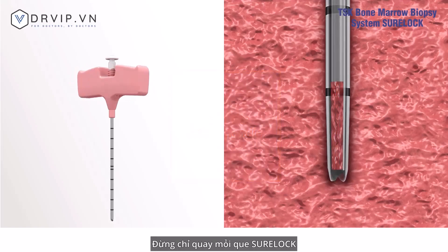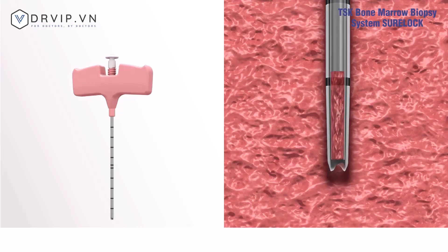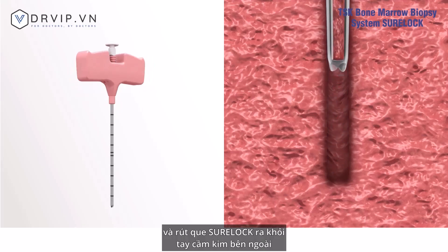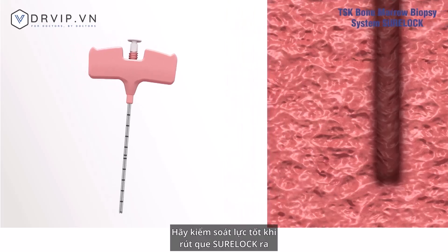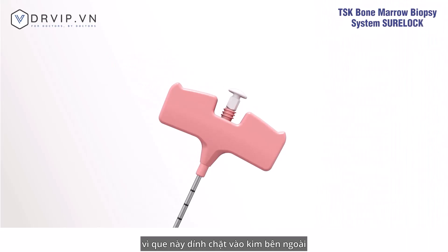Slowly pull out the outer needle handle completely from the puncture site while rotating half turns left and right, then remove the SURELOCK from the outer needle handle. Controlled force might be necessary to remove the SURELOCK, as it is firmly attached to the outer needle.